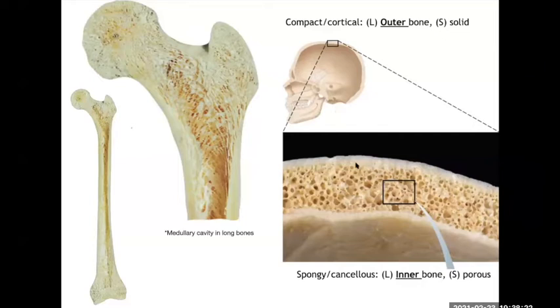All right, everybody clear on that? And we'll talk about the structure of these two types of bones right there. So if I ask you how many types of bone tissue there are, or if I say identify this bone, be specific, you'll either say compact or spongy bone.